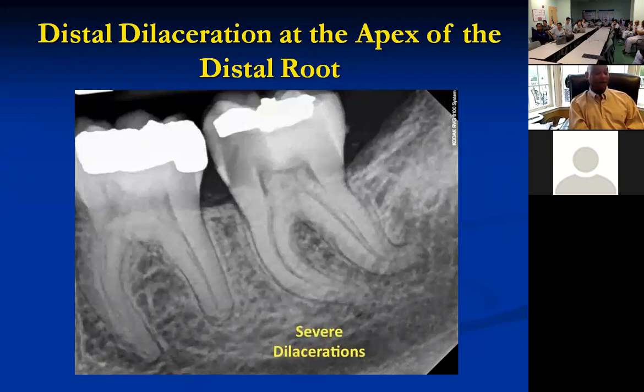And those are tough to get, because sometimes you see them and you just see 1 orifice and you think, okay, maybe there's just 1 canal on the mesial, but you got to get down a little bit further to find that bifurcation on those mesial roots.